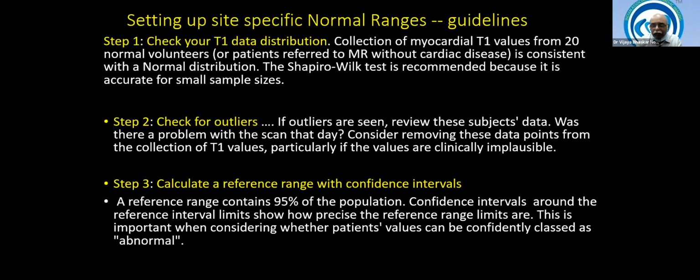Yes, in this second 20, if again there are a lot of discrepancies with the external reference range, then you have to do it all over again. Or if this 20 matches your first 20, not the external reference range, then this 40 is your normal reference range, and use it as your normal reference parameters.